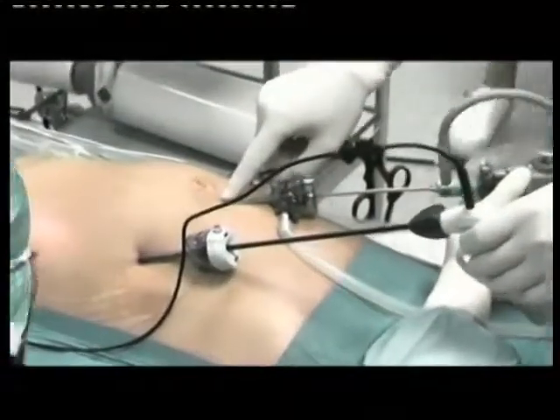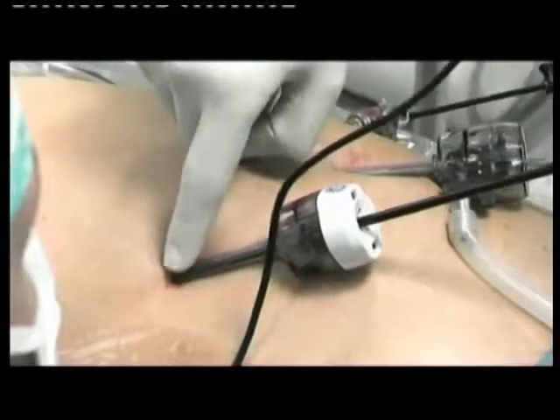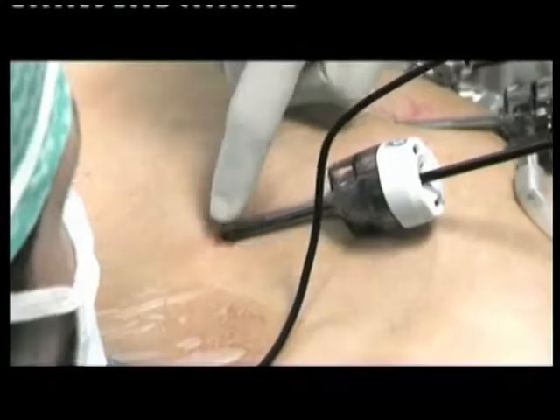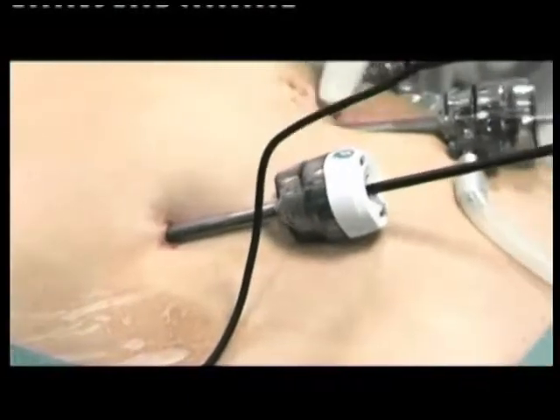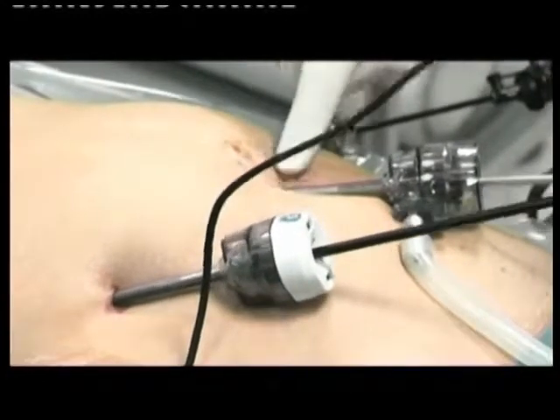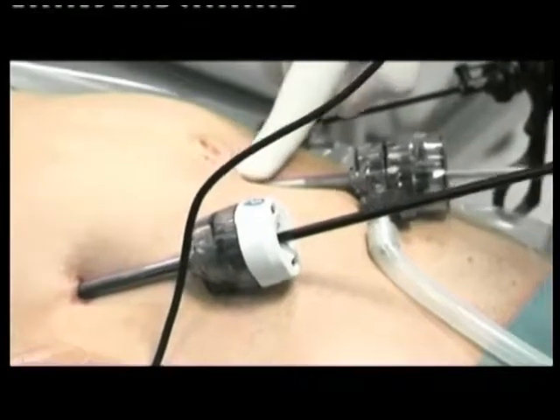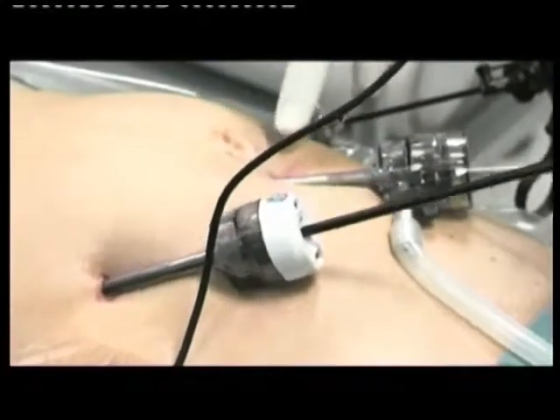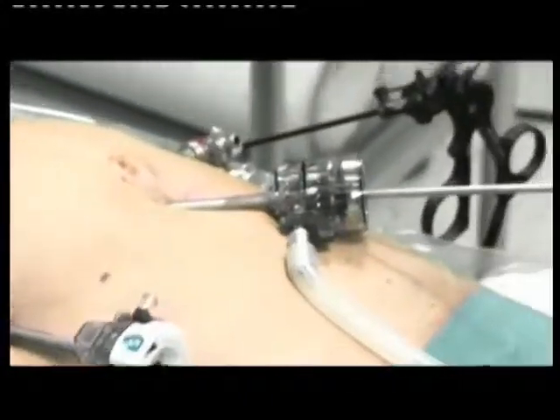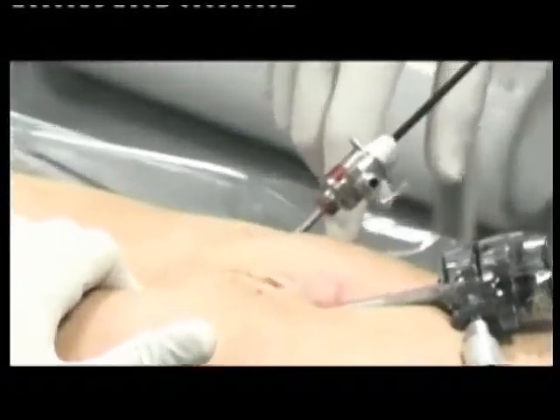This is the optics above the umbilicus. This is the 5 millimeter trocar for the operating instrument for the introduction of the mesh. This is the optics, 5 millimeter optics. We always use 5 millimeter optics. Sometimes, many times, we use 3 millimeter optics because these mini optics are enough for this kind of procedure. And this other one is a 3 millimeter trocar.